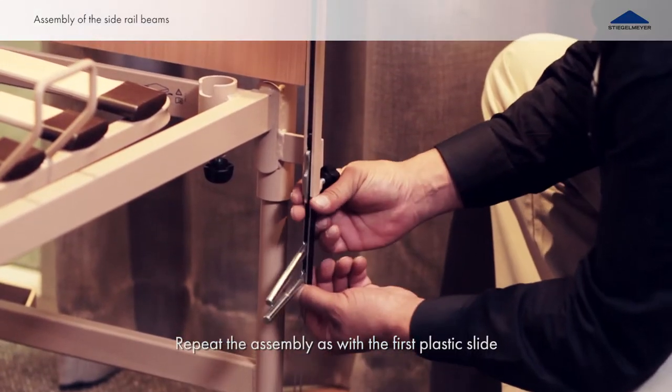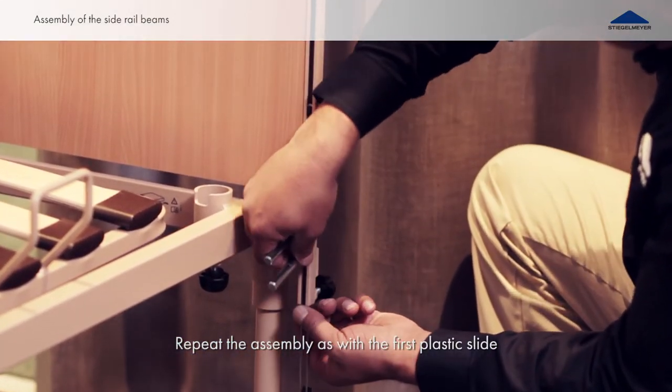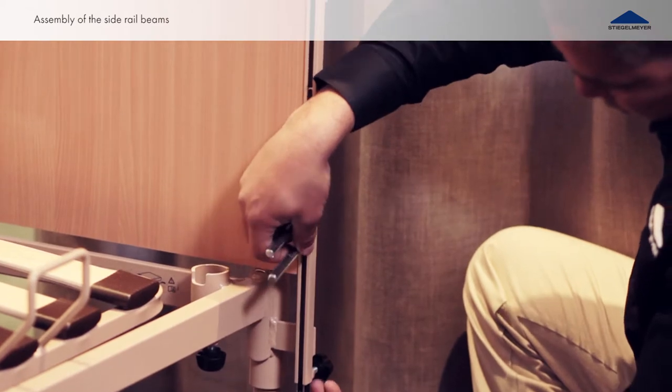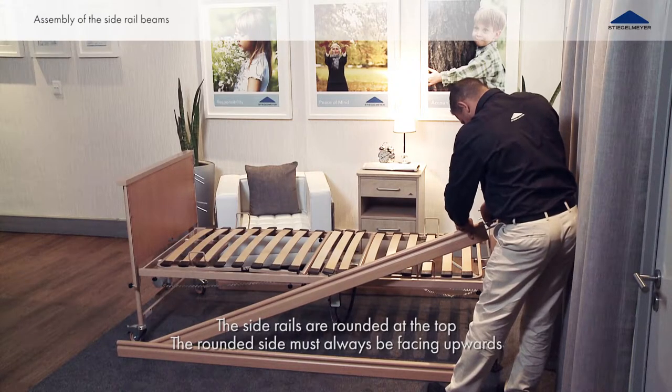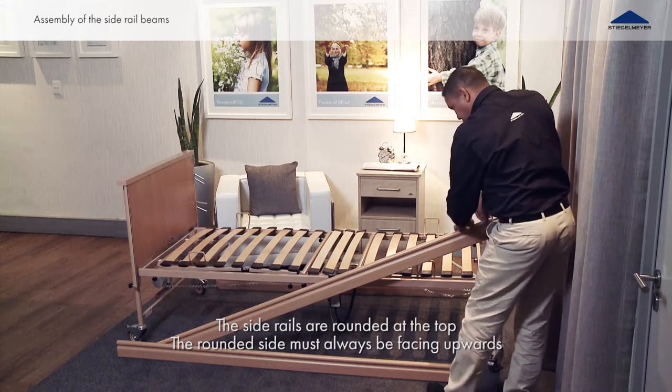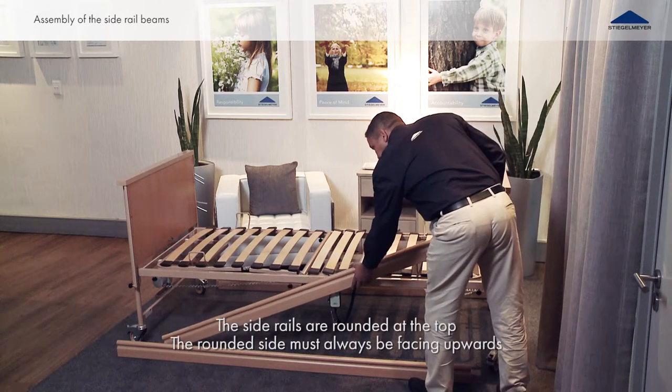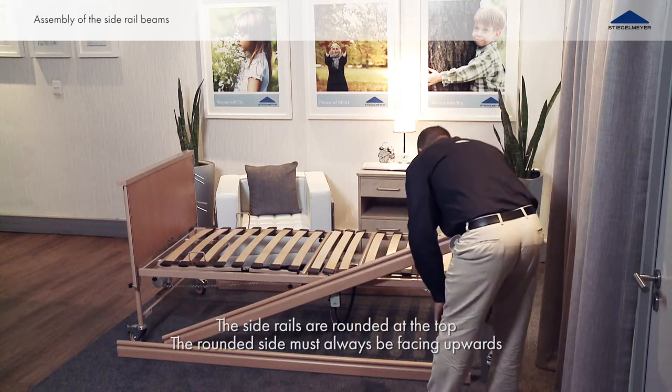Pull the top end of each plastic slide up at the head section until it locks into place. Now place side rail onto the top pair of the metal pins on the head section end board and let the other end of the side rail lie on the floor.